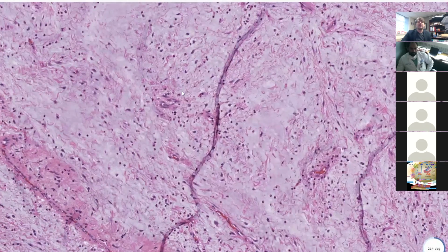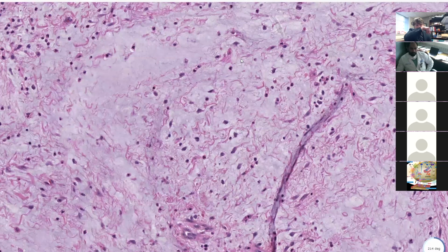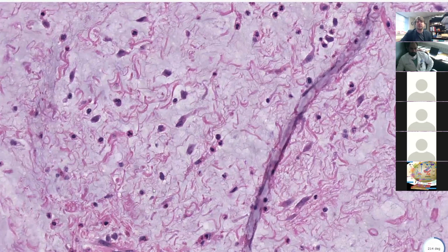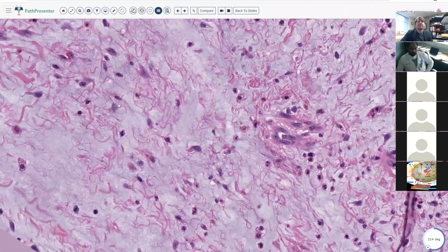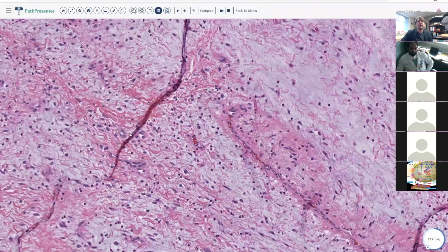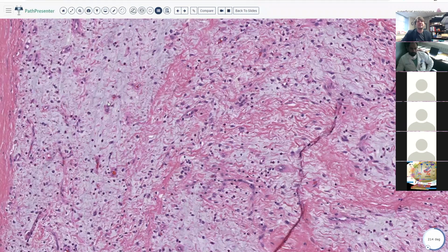And again, the main thing we want to see here is you've got a myxoid lesion that's not very cellular. Is there any significant nuclear atypia? That's the main thing you want to assess here, and we'll talk about why in just a minute. So that's the way the nuclei should look. They're bland and spindled. Sometimes they're kind of bean-shaped or reniform nuclei. That's totally fine. You don't want to see hyperchromatic pleomorphic cells in a myxoid lesion. If you see that, then you've got to start thinking about some malignant options.